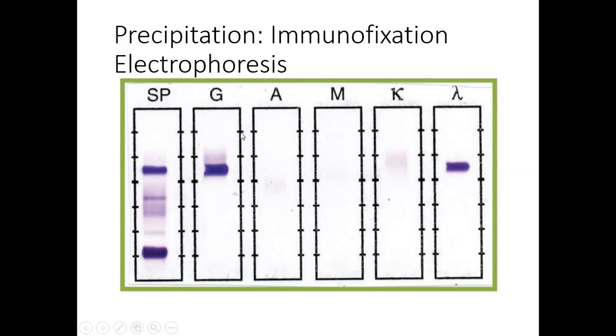Then we go back and we apply a gel solution all across the whole electrophoretic plate. And now the antibody and antigen reaction only has to go up a very small amount vertically because we've already electrophoresed the antigen across the plate, right? And we're going to look for where the antibody, if we look at, there's actually kind of 6 individual wells within here.